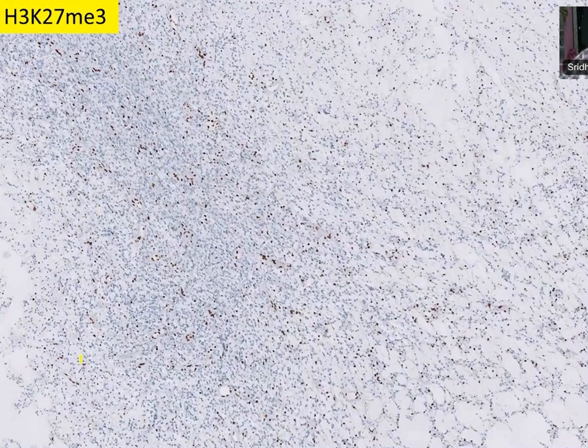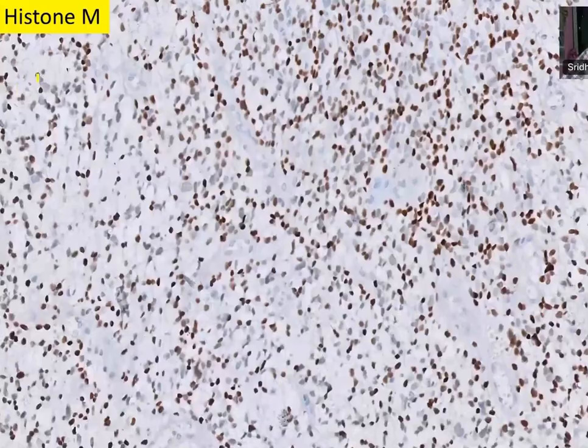Yes. Whenever you have a deep-seated midline location, thalamic, cerebellar, spinal, peduncular, and you have an H3K27Me3 loss, you should suspect diffuse midline glioma. What are the markers for diffuse midline glioma? You have H3K27M. This is H3K27M. It's positive, just like IDH1 R132H, an IHC for a mutant protein. H3K27M is a marker for mutant histone protein. This positivity tells you it is histone mutant.